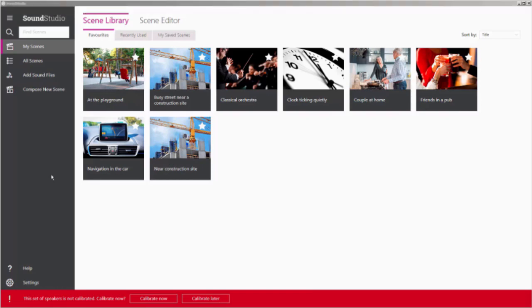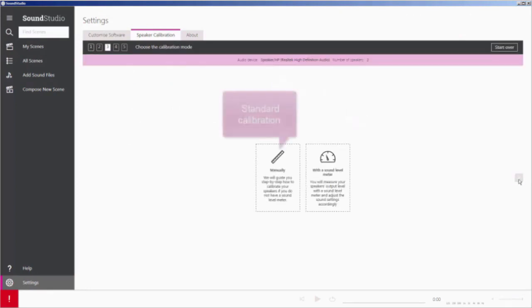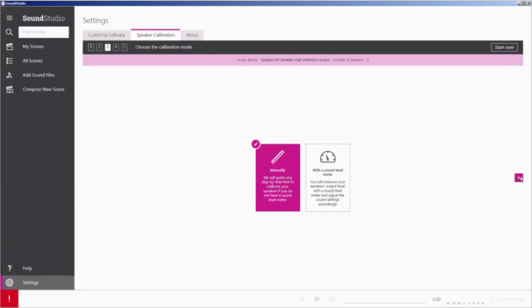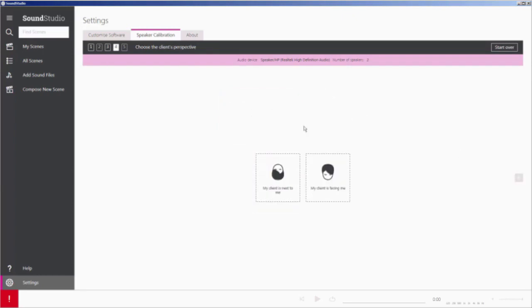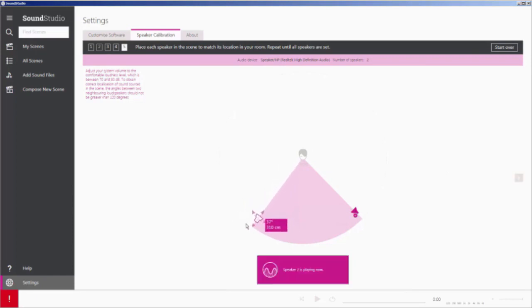Calibration begins automatically the first time you launch SoundStudio. The program will guide you through the process step by step. There are 2 ways to calibrate SoundStudio: standard calibration or calibration with sound level meter. Standard calibration adjusts the output level according to the distance between loudspeakers and the client's ear. This ensures that the sound scene is experienced realistically.